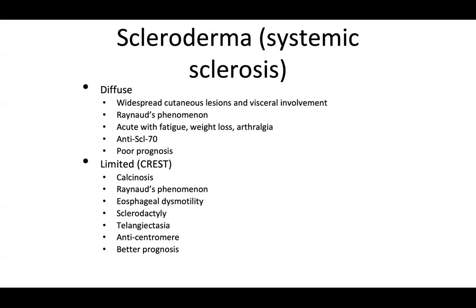The sclerosing dermatitis pattern may be the top line, but there may not be as much inflammation as you would expect if you see the word dermatitis, and that's because it can be very burned out as well. So in the comment, there should be some kind of description about how much inflammation there is as well.